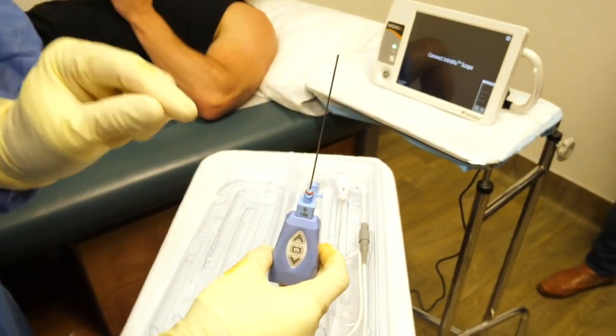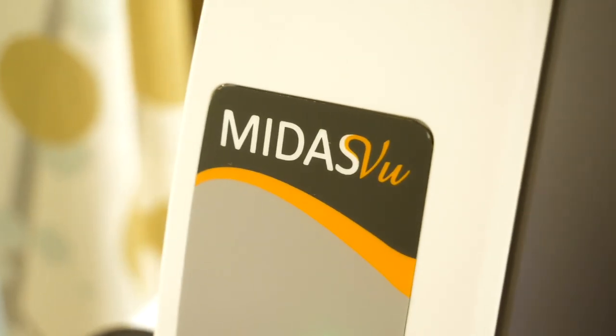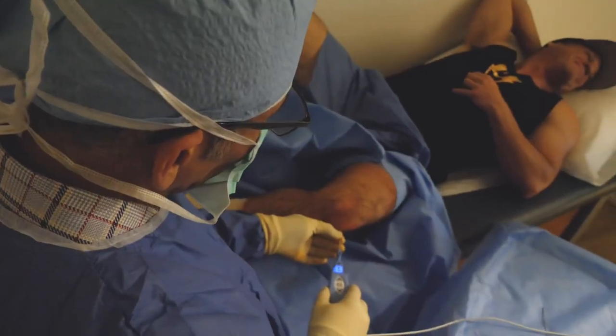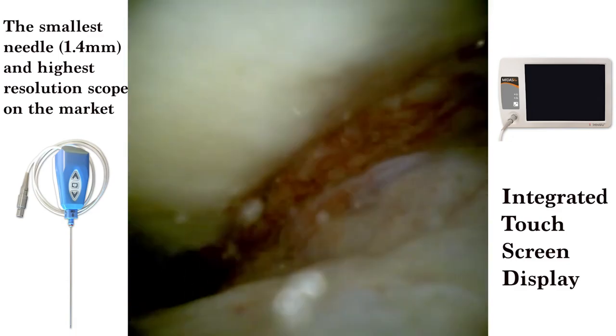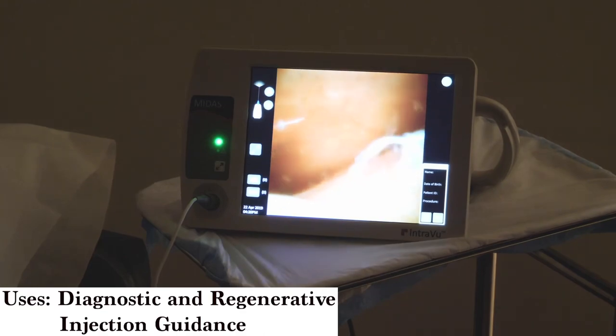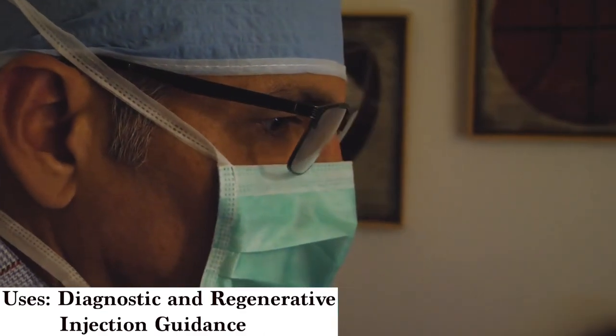This particular needle scope is called the Midas View. It's made by Interview Medical. It's a device that has the highest resolution — 600,000 plus pixels — and a 1.4 millimeter cannula. That's why I like this device. It's small and it helps to define the patient's problem so that we can put him on the right path of treatment.